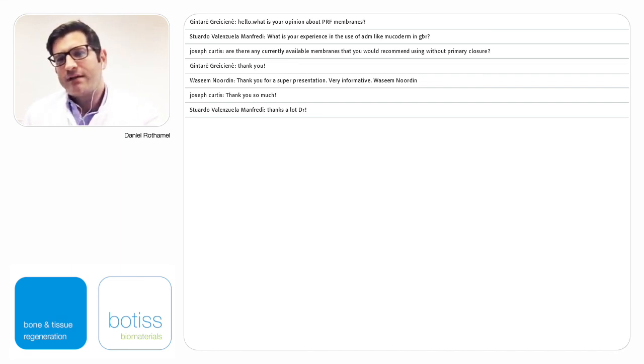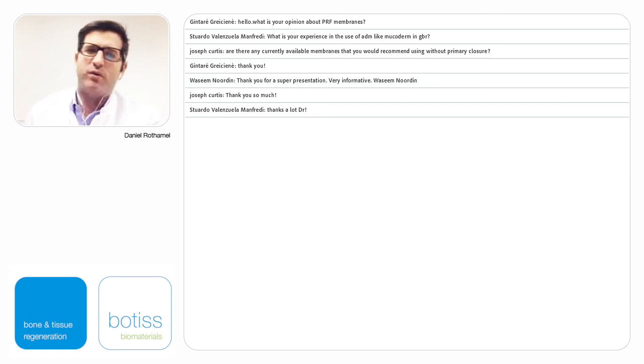But if there is an open system directly after the surgery, you might end up in a contamination and complete loss of the augmented area. So I wouldn't recommend to use a normal collagen membrane in an open healing setting. However, there's a new membrane that is a more occlusive membrane. It's called PermaMem. And with PermaMem, you have the situation that there's not a competition of the bacteria and the blood vessels to invade into the matrix, because it's not a collagen membrane, it's a PTFE membrane.